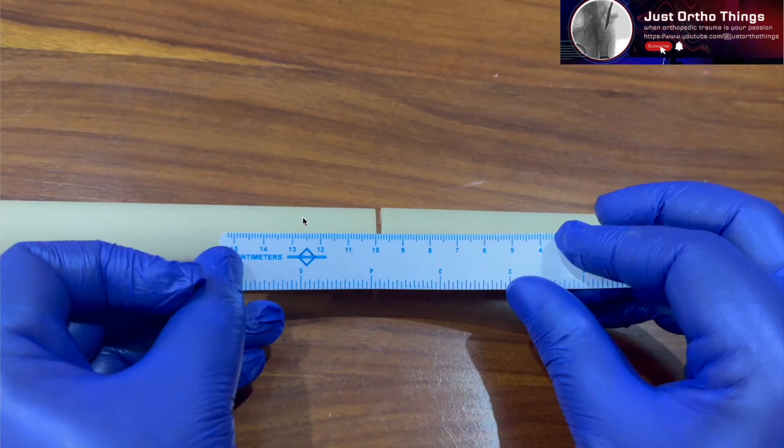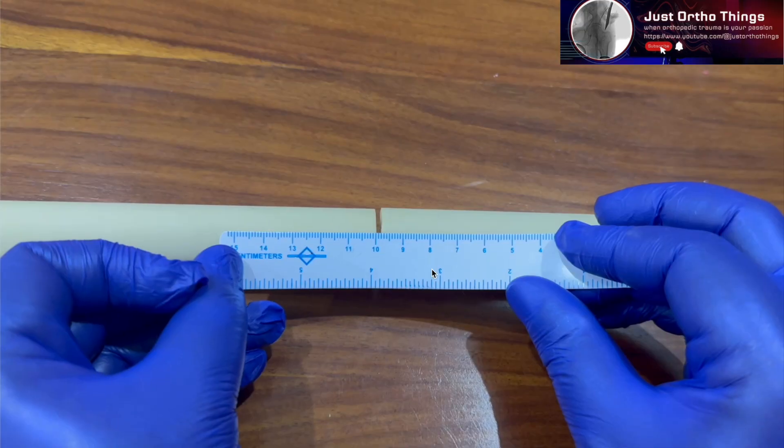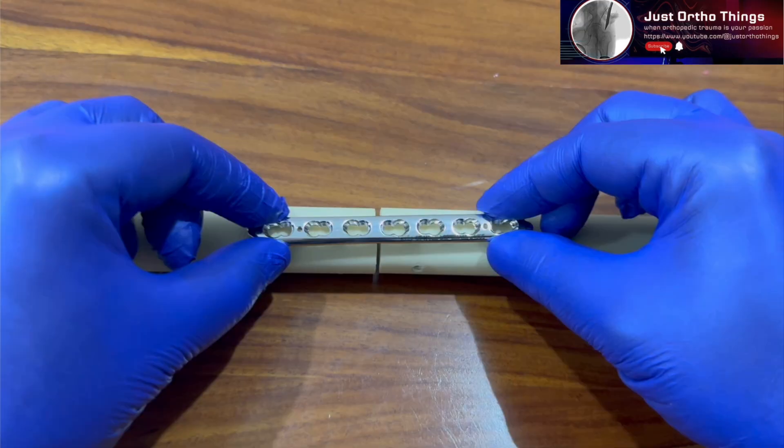Here you can see two sawbone models replicating a fracture where the gap is almost 2 millimeters. Using the dynamic compression plating principle, I will show how to gain 2 millimeters of compression. The gap is obvious. Most plates available these days are locking compression plates, meaning they have both locking and compression plating modes. I will be using this locking compression plate so everyone remains familiar with the technique.